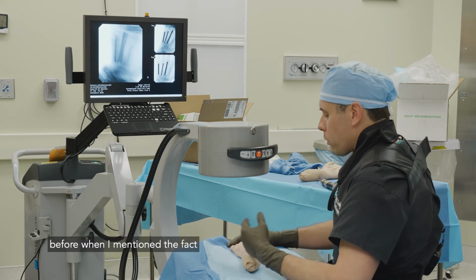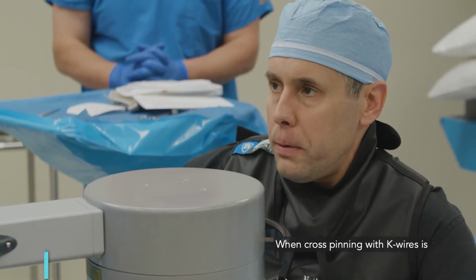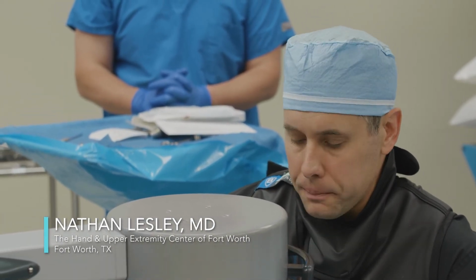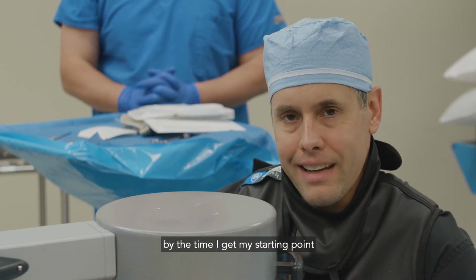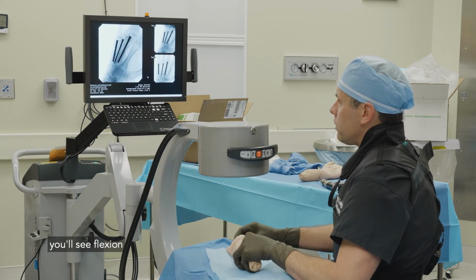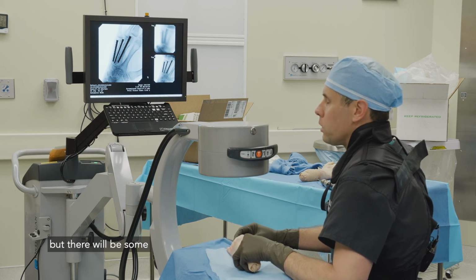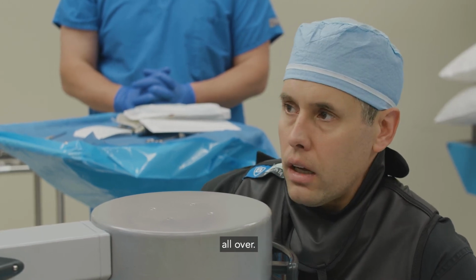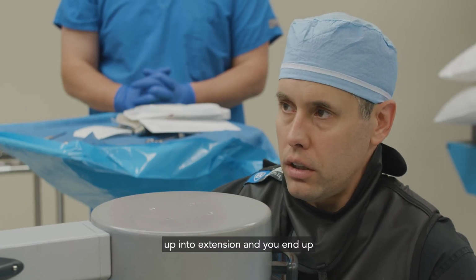The other thing I was getting at before when I mentioned the fact that this nail almost self-reduces the fracture: when cross pinning with K-wires, it's difficult to find the starting point and to get the starting point correct on that collateral recess. So much attention, at least in my hands, is directed towards that that by the time I get my starting point and get the K-wires across, often I'll take this x-ray and you'll see flexion. Maybe not significant, maybe 20, 30 degrees of flexion at the fracture site, but there will be some. And you're certainly not inclined to go start all over. You don't have to worry about that in this. Advancement of that nail just pulls that distal fragment back up into extension and you end up with a neutral alignment.